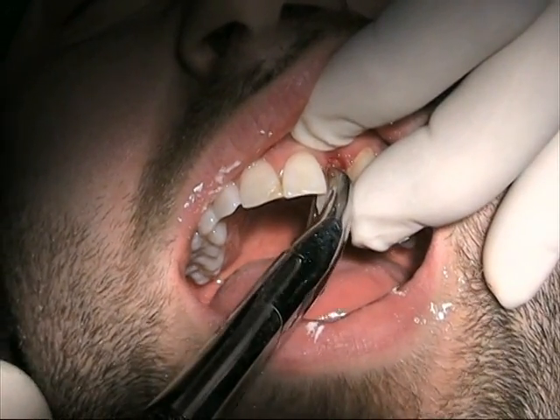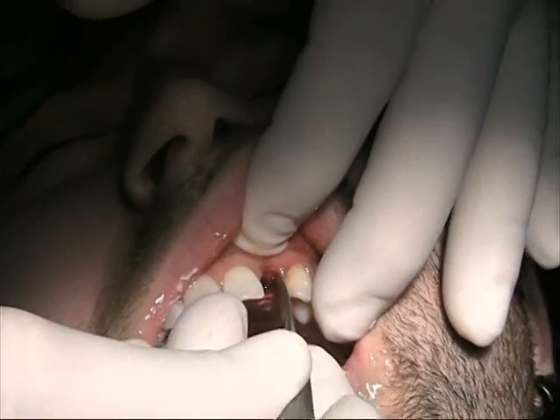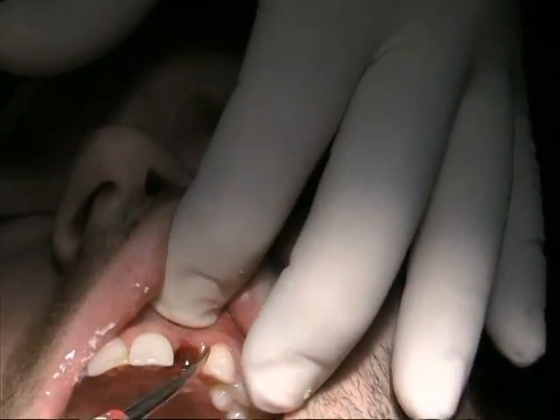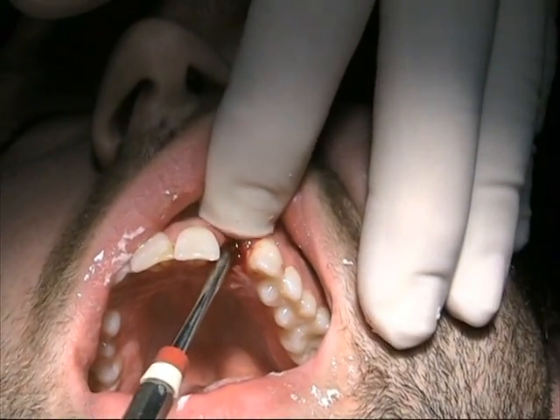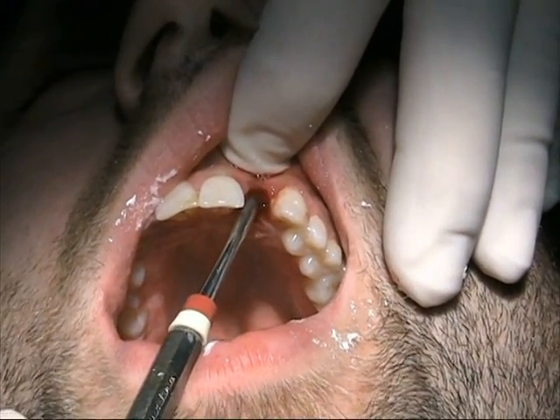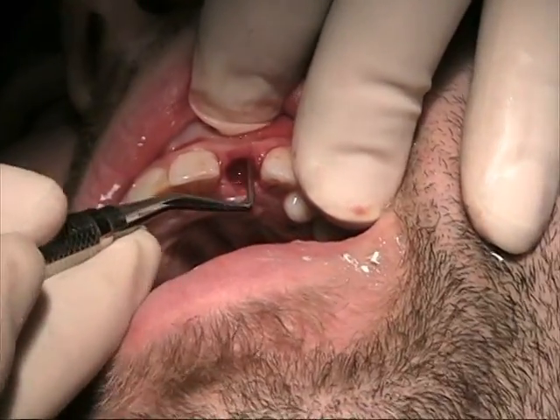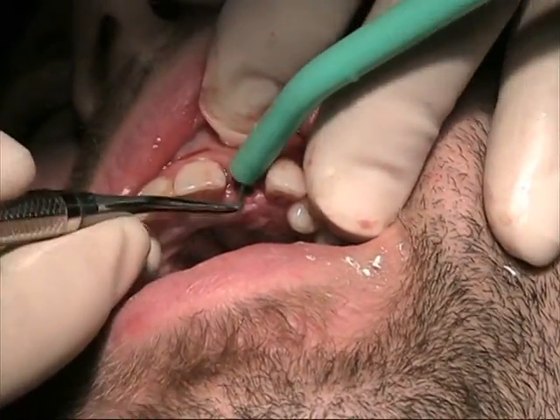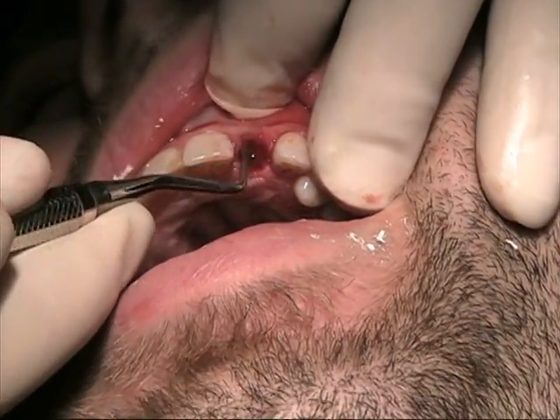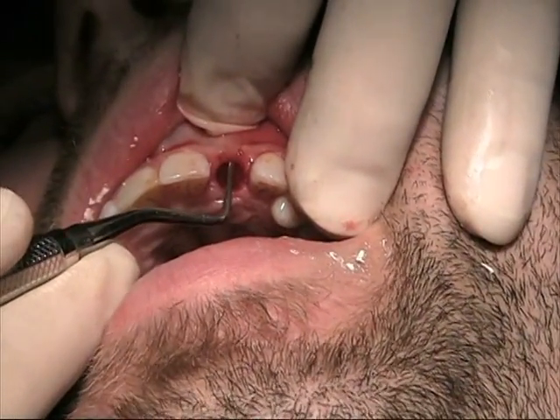Typically there's a lot of connected granulation tissue under these types of teeth — they're kind of similar to external root resorption cases. So at this point we're just going to curet all of this tissue out and then we'll very carefully push forward on the facial tissue and the gingival margin here to see how far down the facial plate loss goes. I tend to use a round periodontal probe to do that. It allows me to feel the buccal facial plate as it tends to curve in. You can see the cleft, how severe it is in that area, and when I push it out that's what I want to attain.